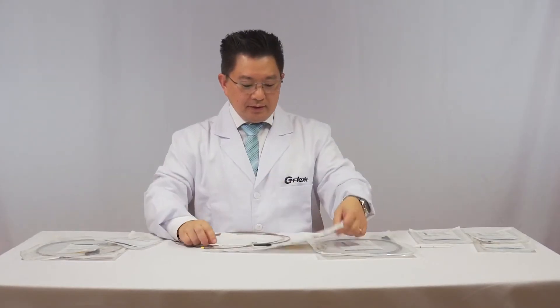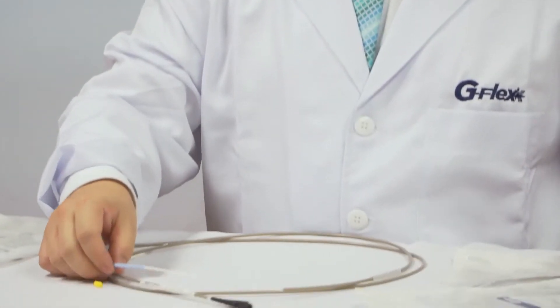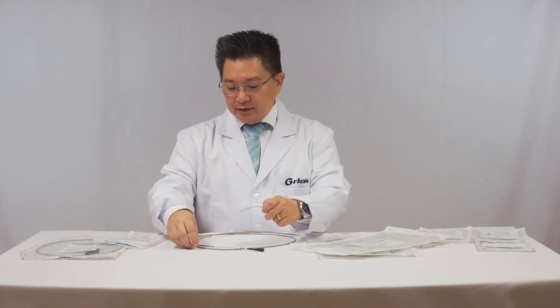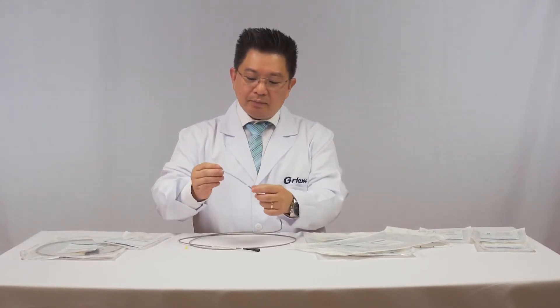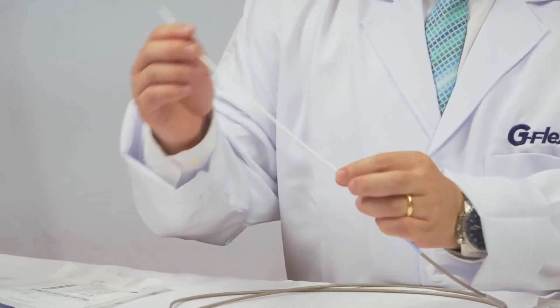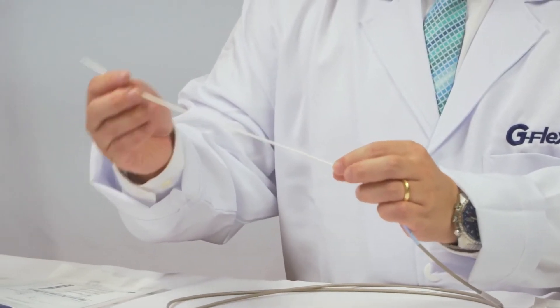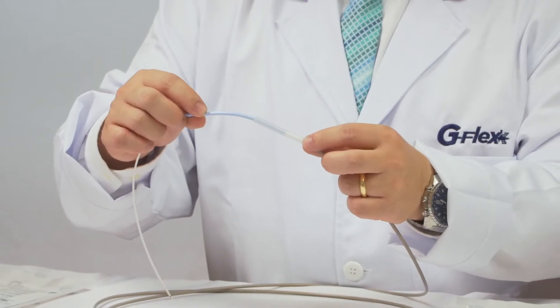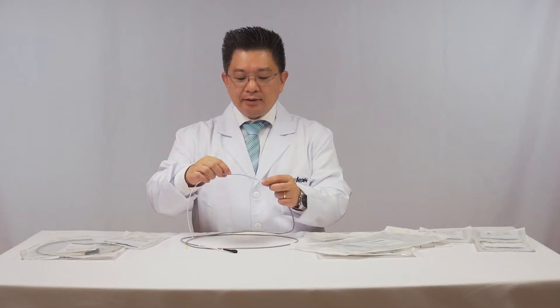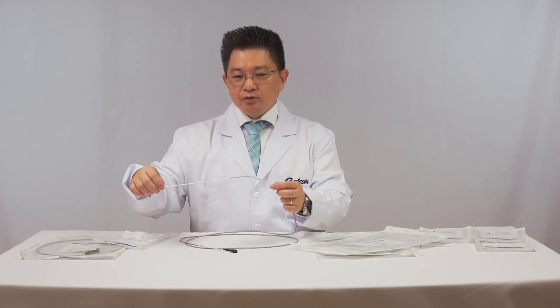This one is the EasyFlex. It's a one-piece type stent, so you have in the same piece the plastic stent, the guide catheter, and the pusher in grey. This is the rectificator to keep the stent straight during deploying inside the duodenoscope.